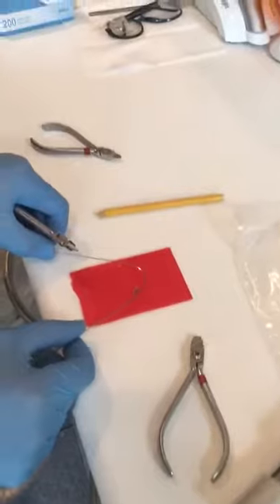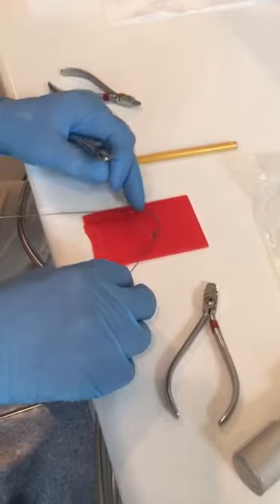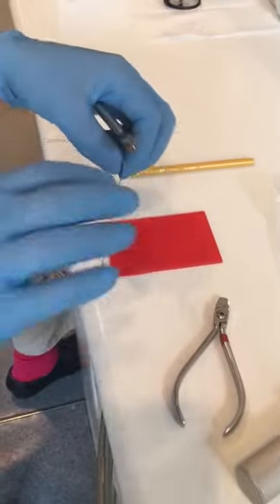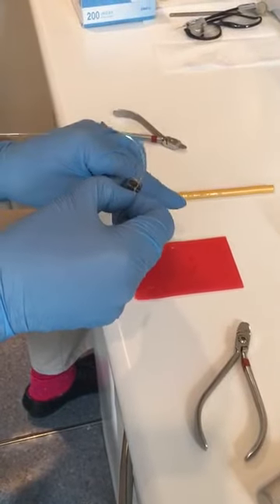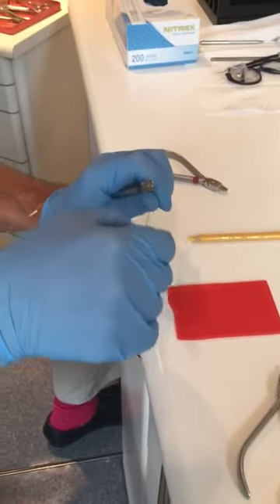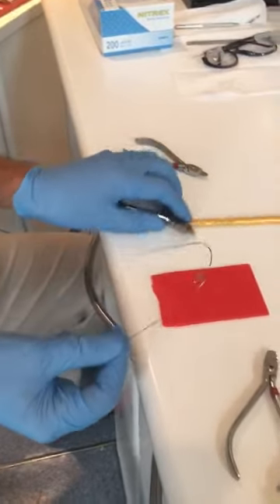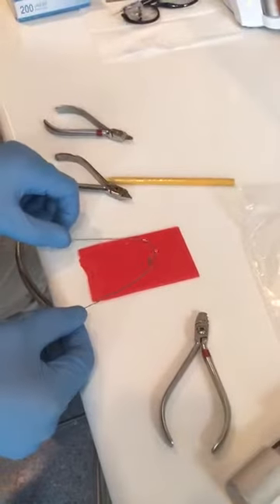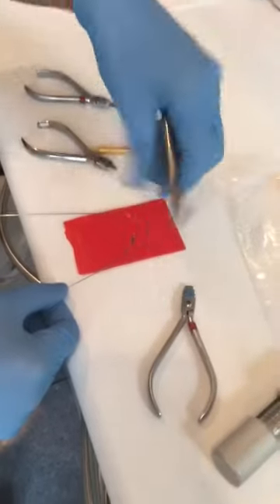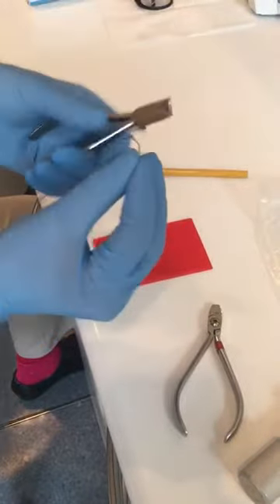So all you now need to do is you need to get the double delta in the right position. So it'll be in between the lateral incisor and the canine, and then just wipe a little bit more curve into the distal part of the arch wire. Wipe a little bit of curve in there. And if I could have some distal end cutters. So we look at that, and we want to make sure it goes back. I don't know if it goes back to the second molar, but there we are. It gives us an option.